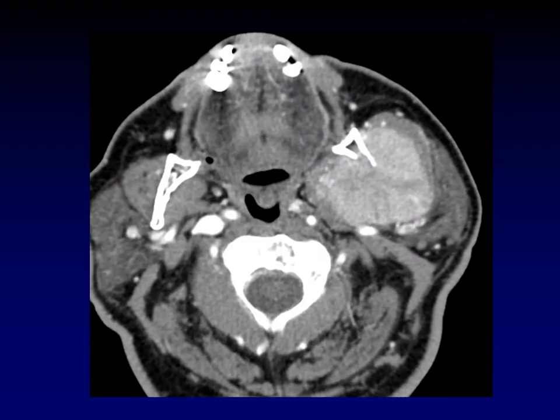Here's another mass of the masticator space. Look how the parapharyngeal fat has been displaced medially and a little bit posteriorly. Also note the destruction of the jaw itself — that's another good clue. This is a metastasis; it happens to be hepatocellular carcinoma, but of course any metastasis could have a similar appearance.